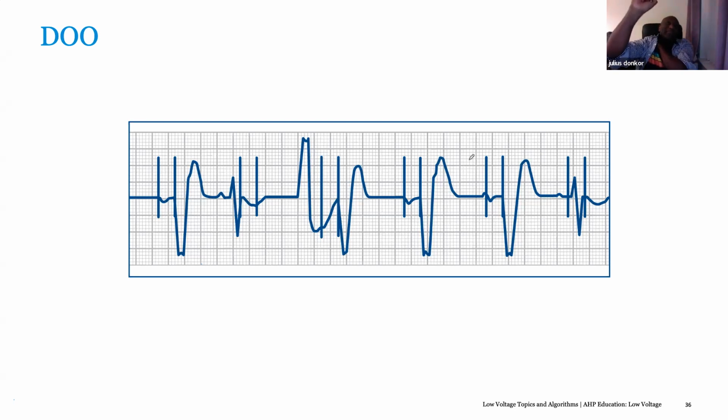Normally when it detects the P wave, the P wave sensing value keeps going down because it's dangling in the atrium, whereas a normal active or passive fixation lead is in a fixed position. So single pass or VDD leads have a habit of displacing.